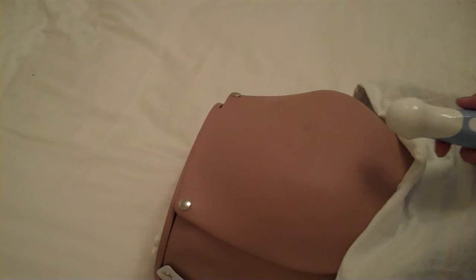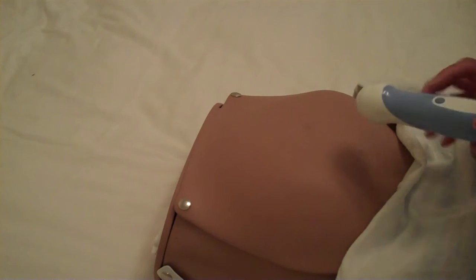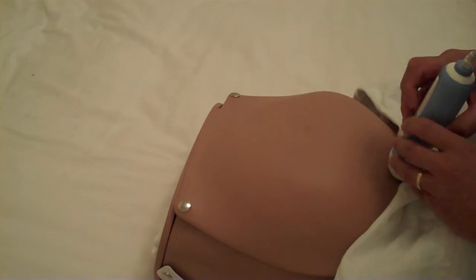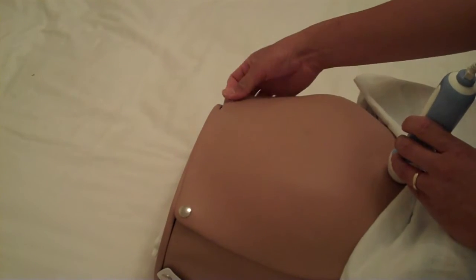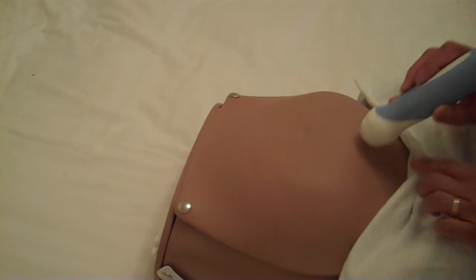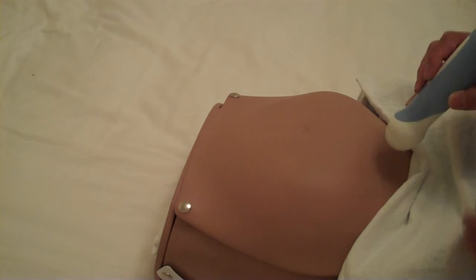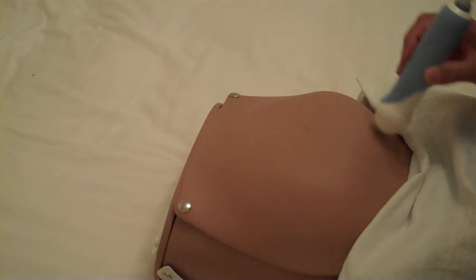So far we've talked about when to scan, where to scan, like this, to look at the birth canal, and the two things we look for, which are placenta previa and breech. We now want to talk about how you can move the probe to look at other areas.